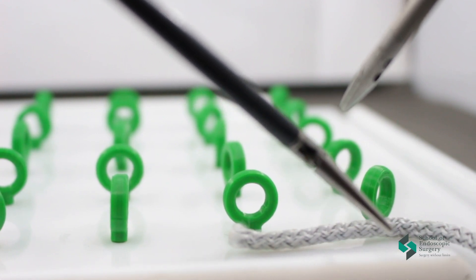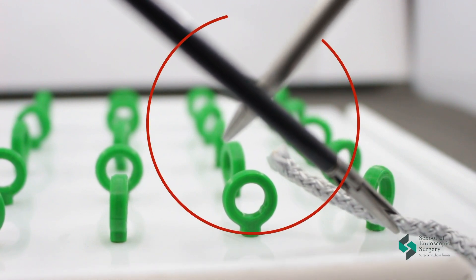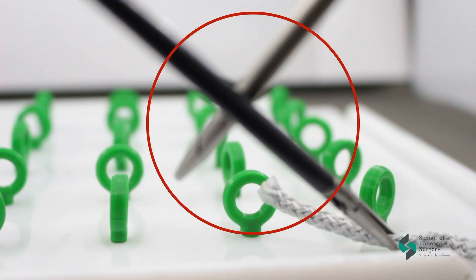Hello friends! Today we are moving on to the second adaptation exercise. Let's start with the rules in endoscopic surgery.